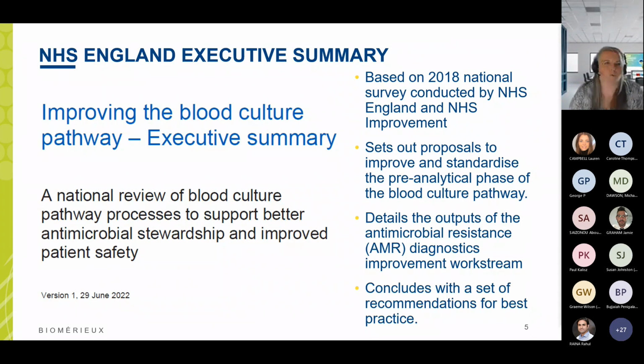So where we're coming from in terms of the blood culture pathway, most of you might be familiar, but in June of last year, NHS England published their executive summary following their findings of a UK-wide survey of blood culture practices. And in this summary, they set out proposals to improve and standardize the pre-analytical phase of the blood culture pathway. And they strongly emphasize the links with improved antimicrobial resistance diagnostics and its impact on sepsis patients. And so they concluded then with a set of recommendations for best practice.